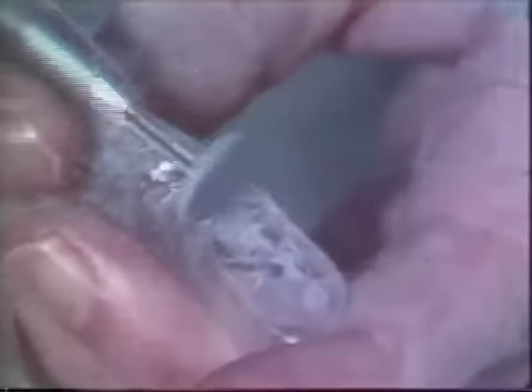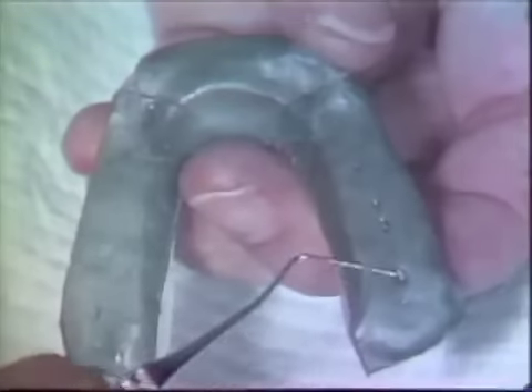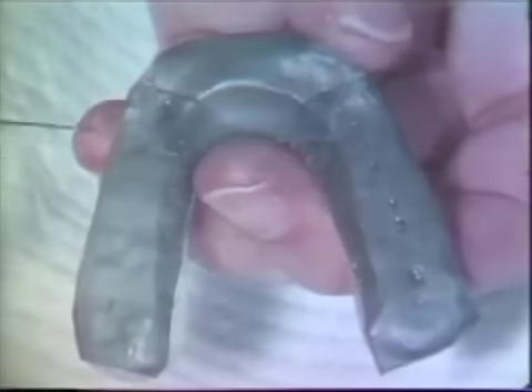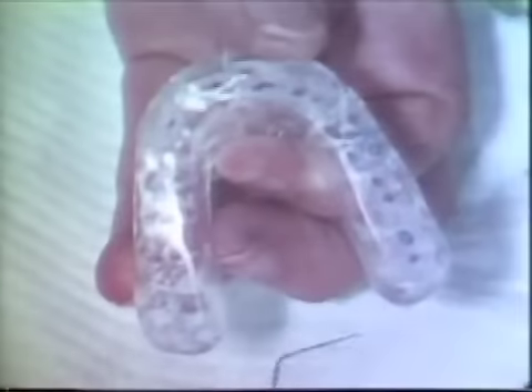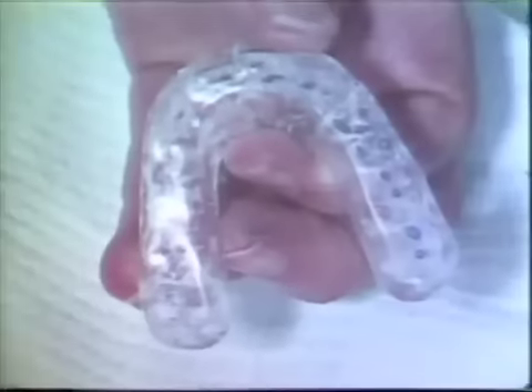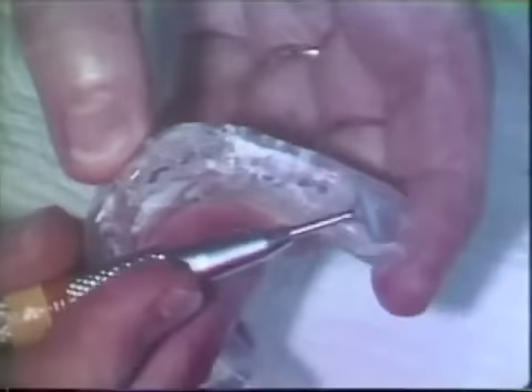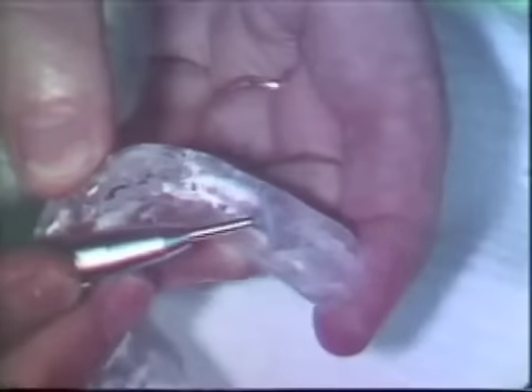Premature contact points are relieved. The bite plane is again tested with wax and must be properly seated each time it is tried in. Heavy contacts are recorded in the left molar regions. The cuspids are in heavy contact, while the rest of the anterior teeth are not touching. Centric relation and lateral as well as protrusive excursions are registered with carbon paper. Carbon markings indicate heavy contacts in the left molar and anterior region, with lack of contacts or light contacts in several other areas. All heavy contact markings are relieved carefully, taking off only a small amount each time.